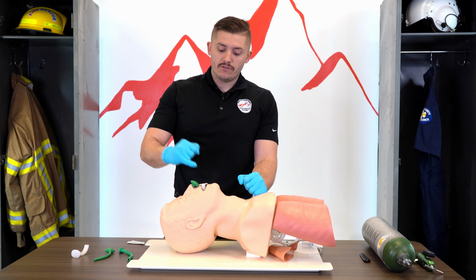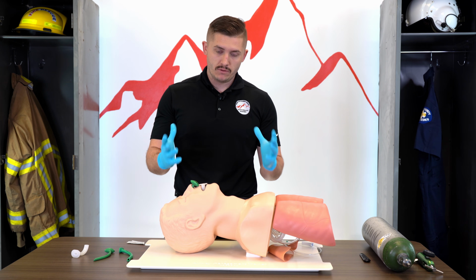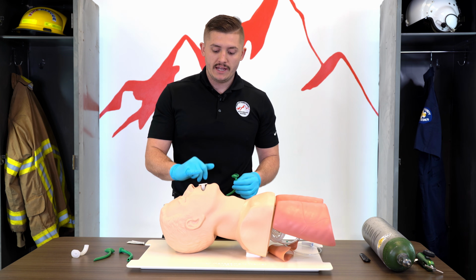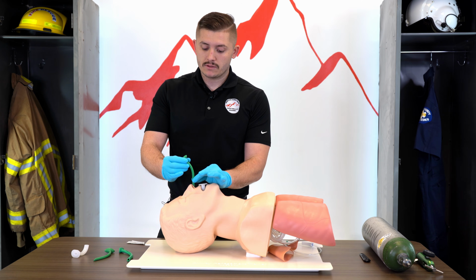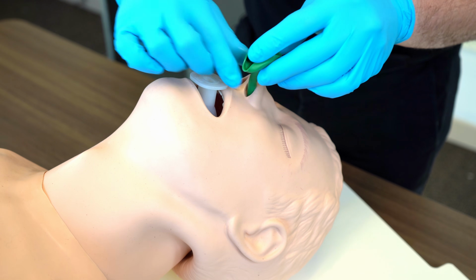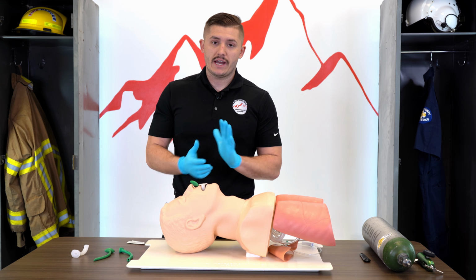So if they have the gag reflex, try an NPA. If they're still fighting that, you might just have to do your best with the head tilt chin lift. The other thing we can do is we can put it in the other naris. Still doing bevel towards the septum. So we're going to place it, and then as we're going into the actual naris, we're going to twist it 180 degrees, just like that.